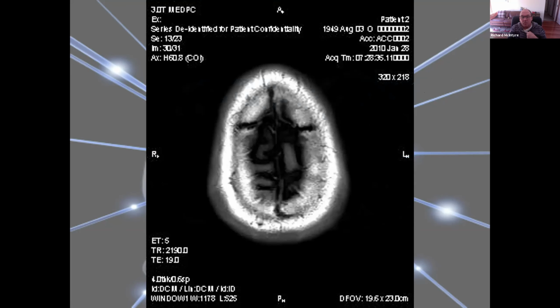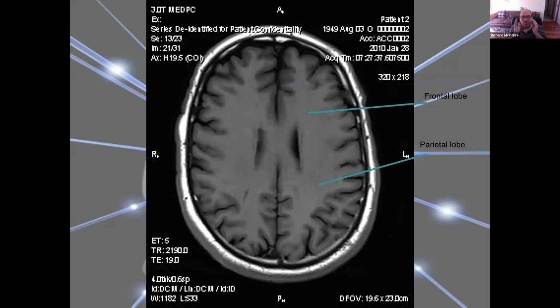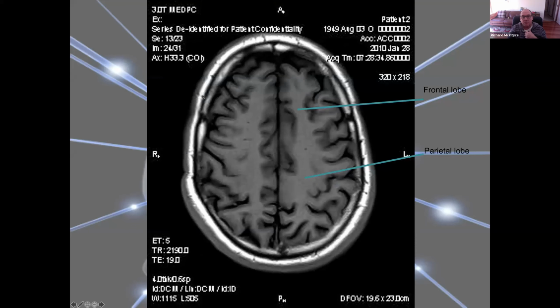And then we come up. You can see with these images that you don't get a lot of information about the skull. This is subcutaneous skin or fat under our skin, and the skull is here. So MRI is not a great modality to look at bones in general. There's exceptions where we actually would do that, and it's always improving, but in general, MRI is not a great modality to look at bones.